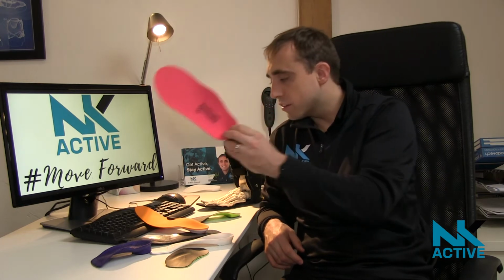From our perspective in clinic, we've got three types of foot orthoses. We've got our modified off-the-shelf devices that we tend to use in clinic. It can be a short-term, long-term device, but they're the cheaper option, with limits to what we can really do with them. Then we can move to something like a semi-bespoke device where we have a pre-formed shell that we can modify to what you need, and then we can move to products that are fully bespoke for you.